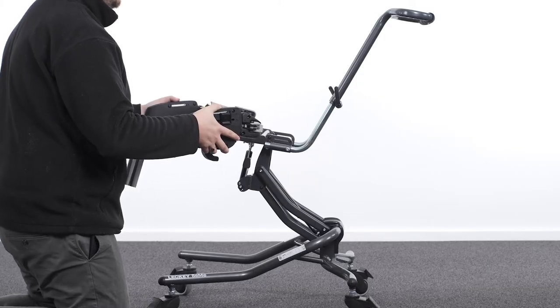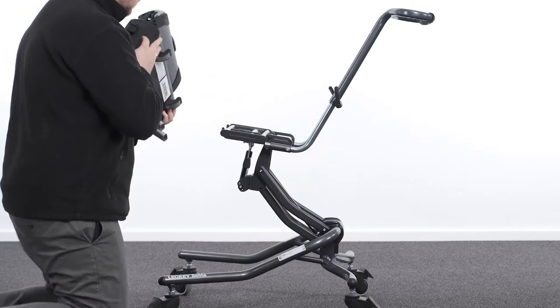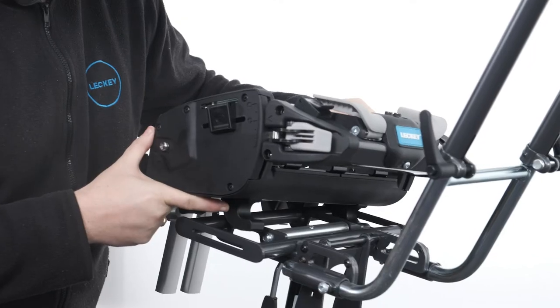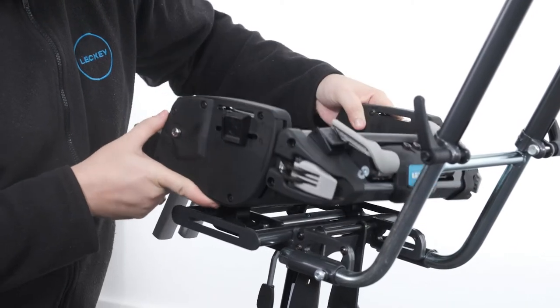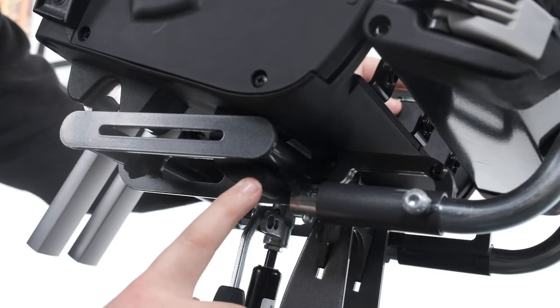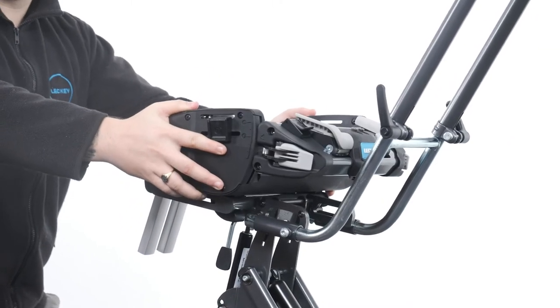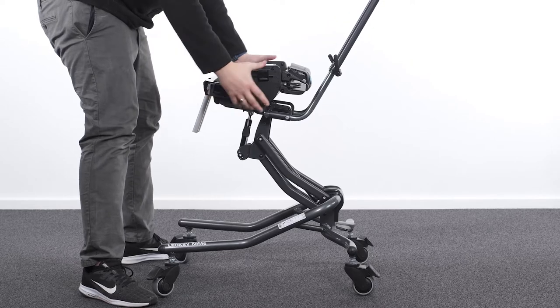Once the locking latches are released, lift the seat base with both hands at either side. On the rear of the seat base there are two hooks which are to be aligned with the rear tube of the chassis interface. Rotate the front of the seat down, pressing down firmly until an audible click of the locking latches is heard. Check that it is secure by pulling up on the front and rear of the seat core.